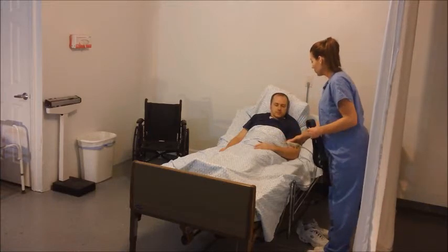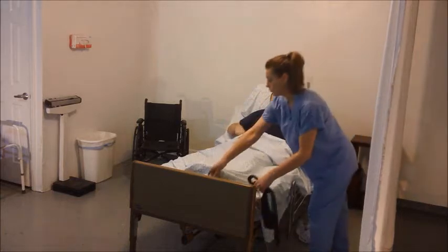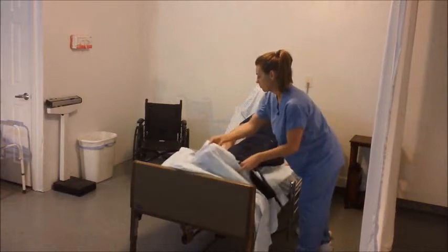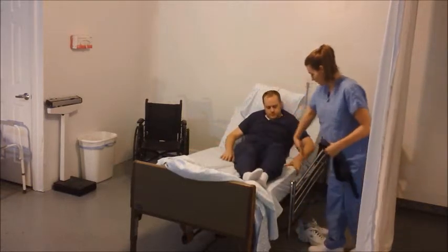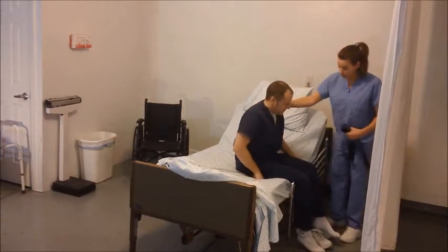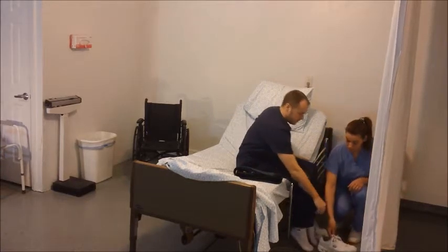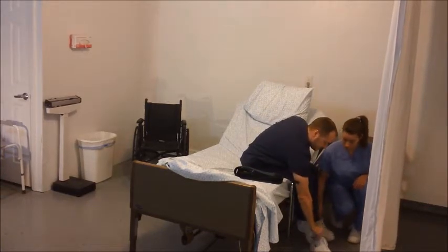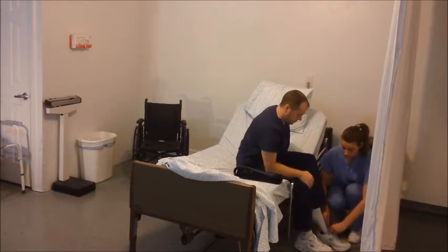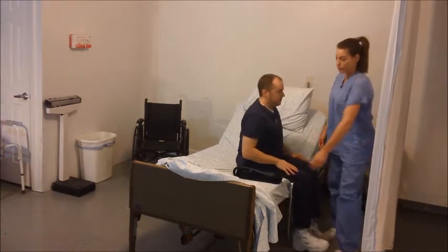If assisting the client from bed, make sure the bed is at a safe level before assisting client to stand. Assist the client to a sitting position with feet flat on the floor. Make sure client is wearing shoes before assisting to stand. If assisting the client from bed or wheelchair, check and or lock the wheels before assisting client to stand.